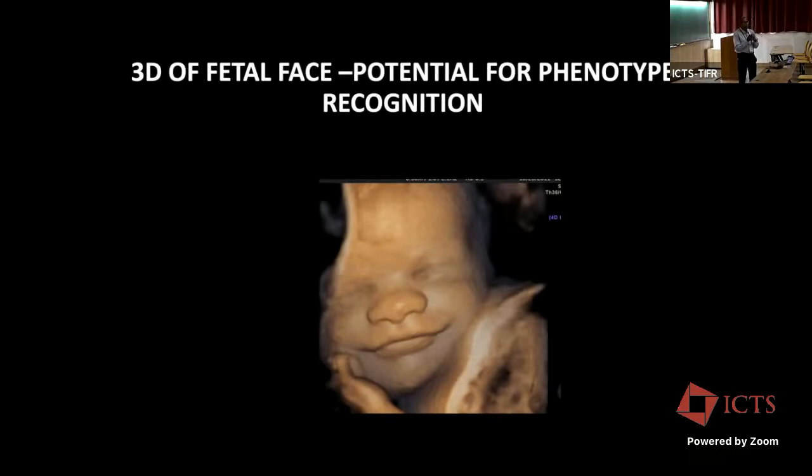And what one doctor in Europe has done is he has looked at fetal behavior and correlated with behavior outside when the baby comes outside. So he says there's a potential for identifying cerebral palsy or impaired growth, in intellectual growth after the baby is born. He's done some studies, but still it is not validated around the world. But again, I'm saying there is a potential in this area which can be worked upon.